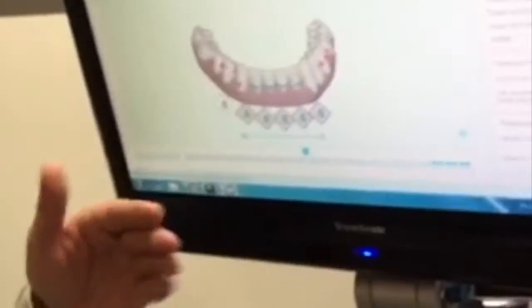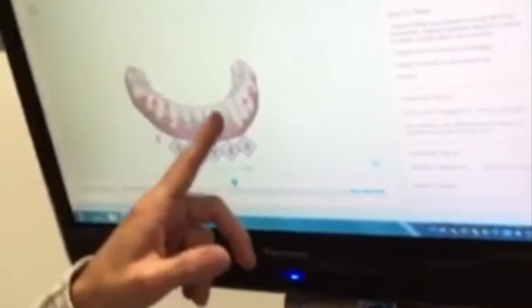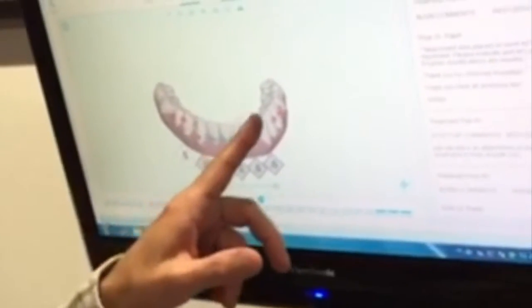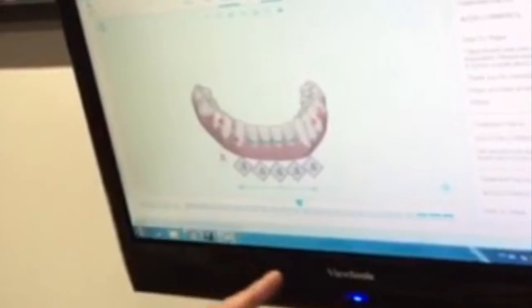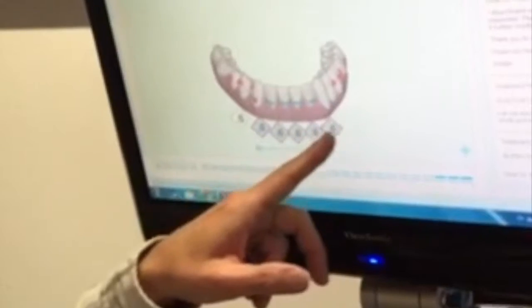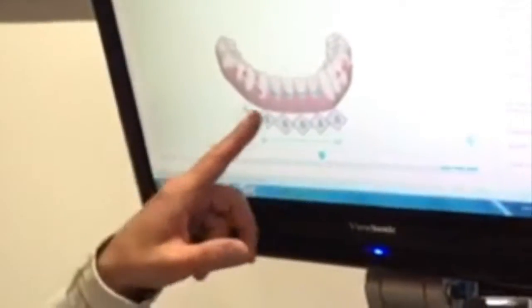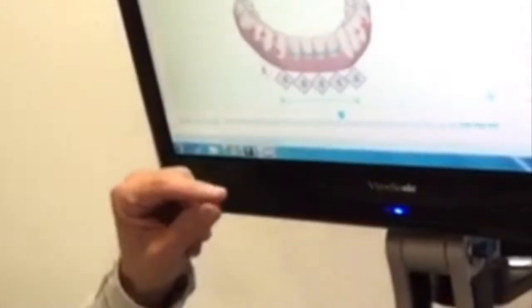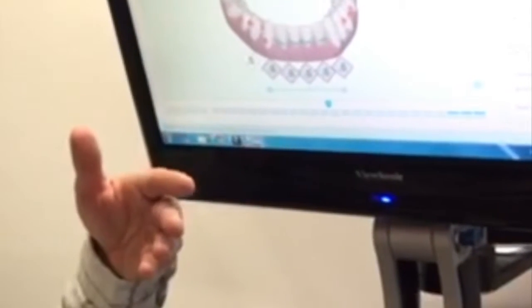Because in the beginning, we've created some space between these teeth in the anterior from canine to canine. And over the course of the treatment, we've now finally reached the point where we've completed the 0.6 millimeters required in order to create the space to move your teeth into alignment.